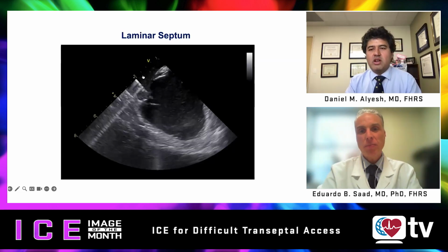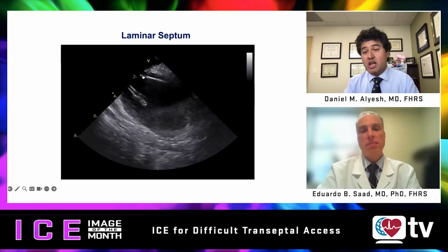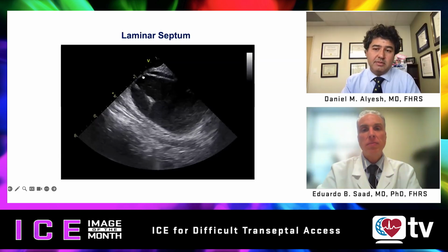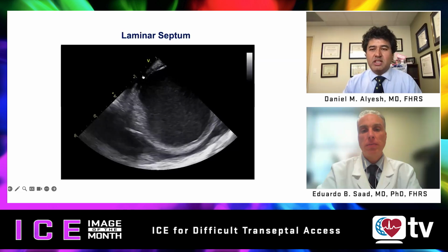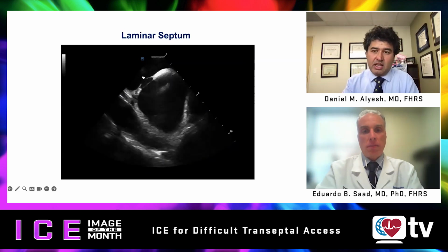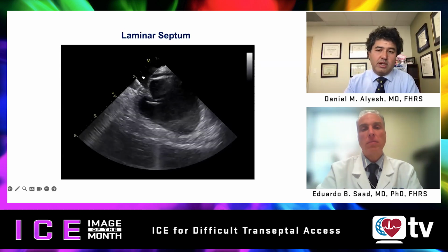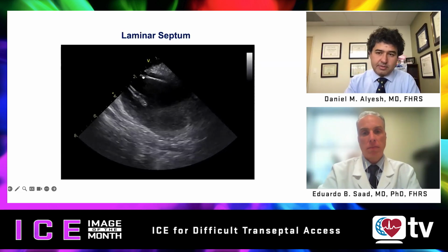Yeah, I think there's a fair number of people that use the tactile feedback for the transseptal puncture, and maybe they're not using ICE as much. And so really understanding that the tactile sense is going to feel like two punctures, and really visualizing the apparatus getting through both before you inject your saline and advance your wire.